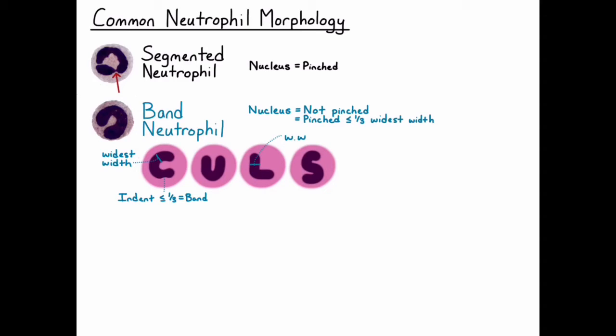However, if we have a pinch that is even deeper, so in this case we have a deeper indent that's greater than 1/3 of that widest width, then we would classify that neutrophil as a segmented neutrophil.